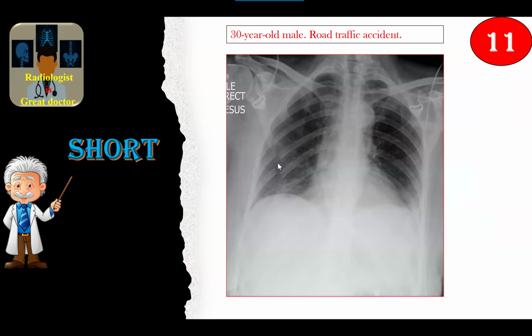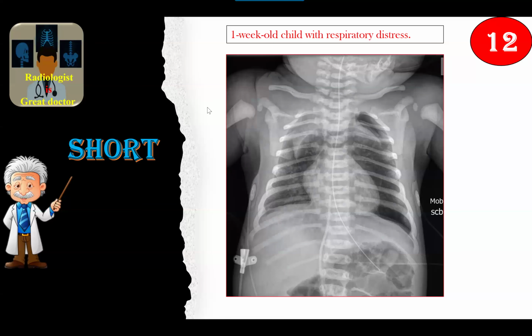Another case, also emergency. Remember, my friends, chest cases will represent about 50% of the short reporting exam. What do you mean by 50%? About 12 to 13 cases. So I'm expecting in the exam a mediastinal mass. You have to prepare yourself. I'm expecting a pleural mass or pleural thickening. I'm expecting roughly 3 cases, 2 or 3 emergency cases at least.